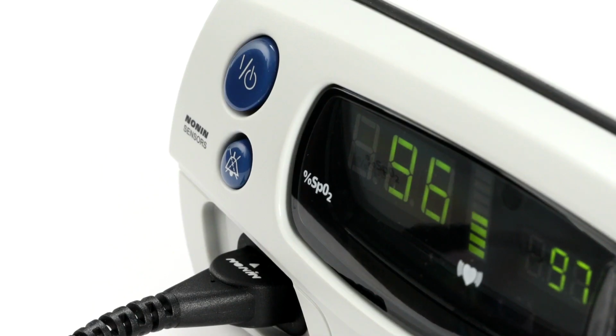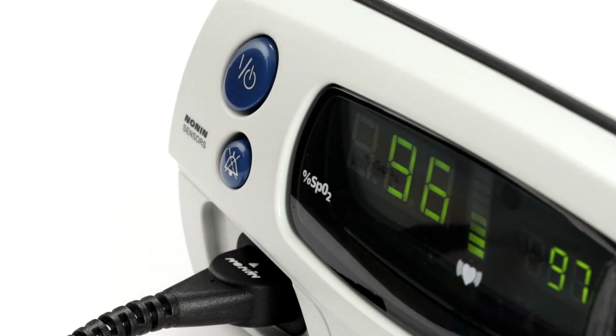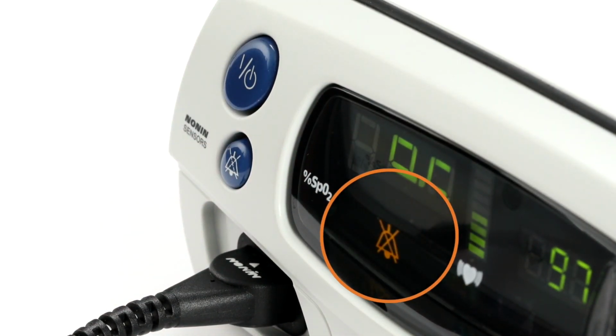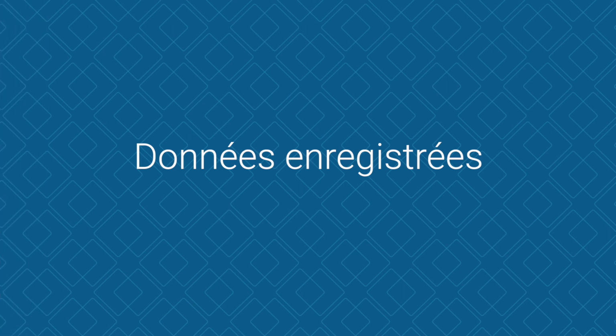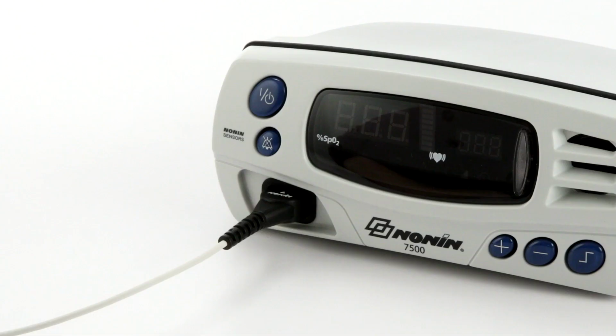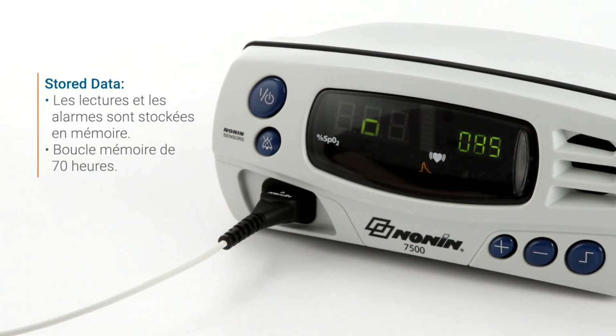You can silence the audible alarm for 2 minutes by momentarily pressing the alarm silence button. And you can return the audible alarm by momentarily pressing the alarm silence button. When oxygen level or pulse rate return to the preset range, the alarm will stop and return to normal monitoring function. Stored data is retained for the last 70 hours of use and then records over the oldest data in 4-minute segments. Data can be downloaded and analyzed on Nonin's Envision software.